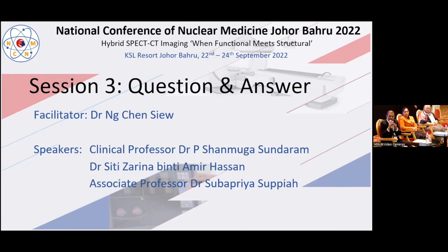And majority of the time, more than 80% of the time, the dual phase is going to pick up. So I reserve the subtraction scan only for those 20% of patients where you are going to have a rapidly washing out adenoma. And this rapidly washing out adenoma is also taken care of with the SPECT-CT, because I do SPECT-CT as a routine in almost all of the patients. So because of this, I don't prefer to do a subtraction scan and the dual phase scan in one phase.